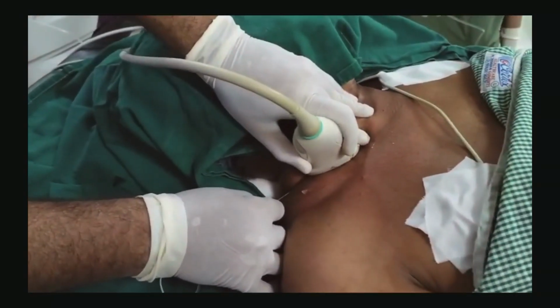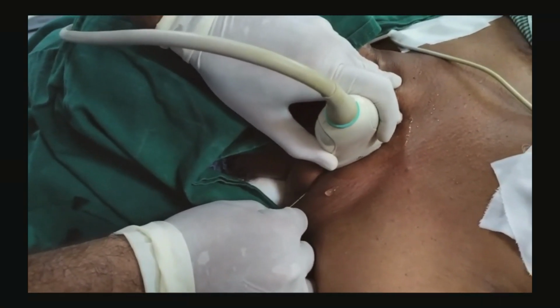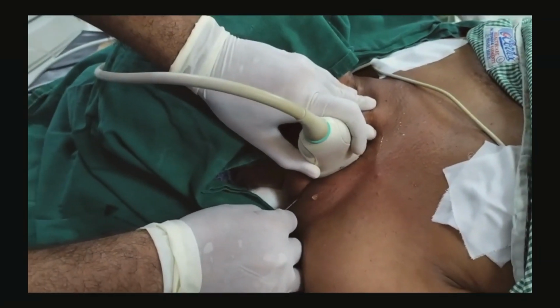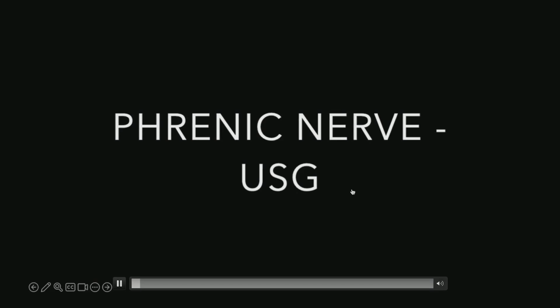So some anesthesiologists advocate an out-of-plane approach to the interscalene groove. When doing in-plane needling, while traveling to the middle scalene muscle, be aware of the dorsal scapular nerve and long thoracic nerve. So finally, how to identify the phrenic nerve with ultrasound.